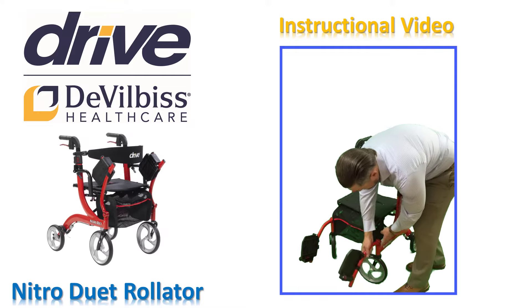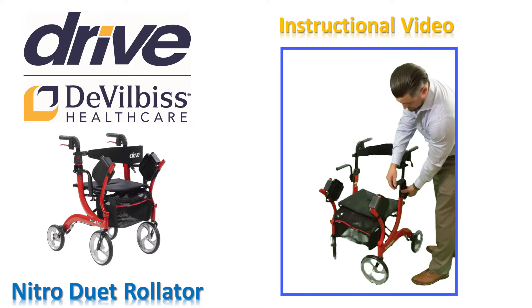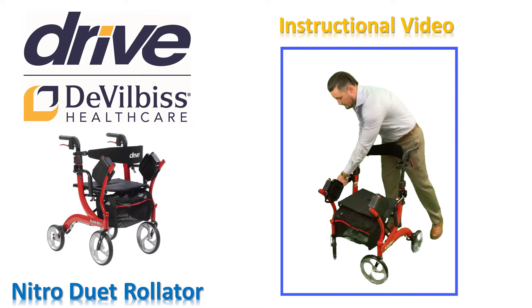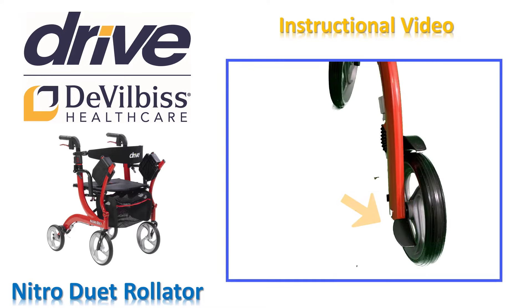When you are ready to walk again, simply flip up the footplates, lift up the legrests until they lock into place, press the black buttons located near the armrests to drop them back into their original position, and finally flip the backrest into its original position. When used as a rollator, the Nitro Duet has a feature to help you safely go over different surface heights like curbs or door thresholds.